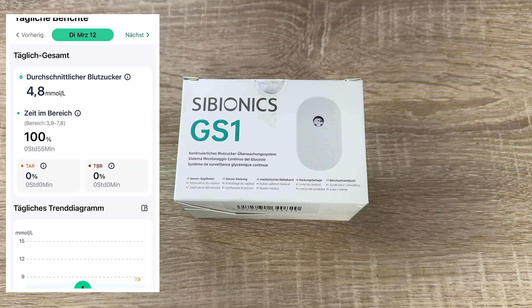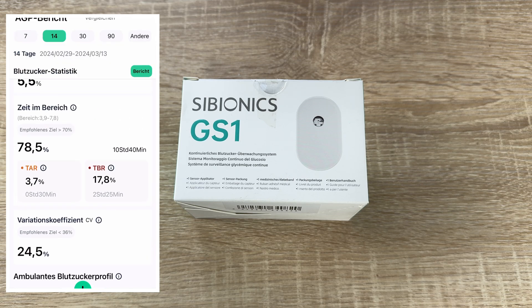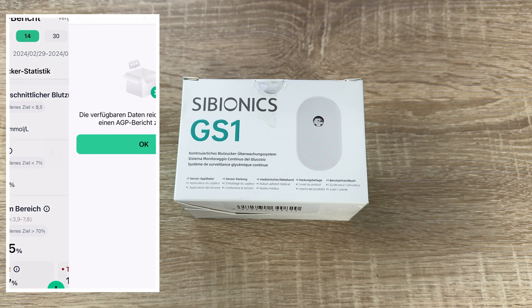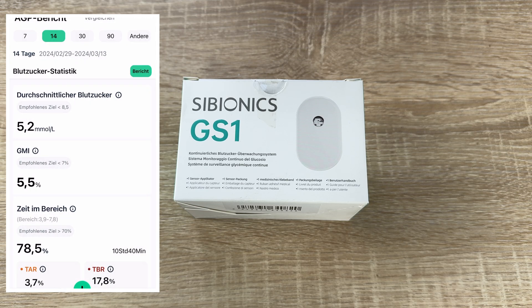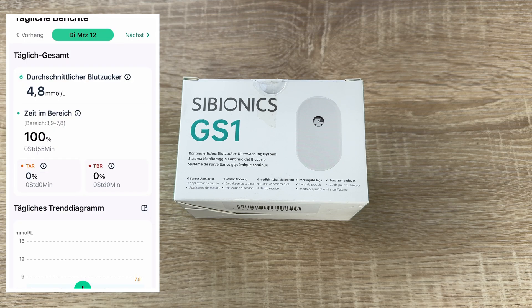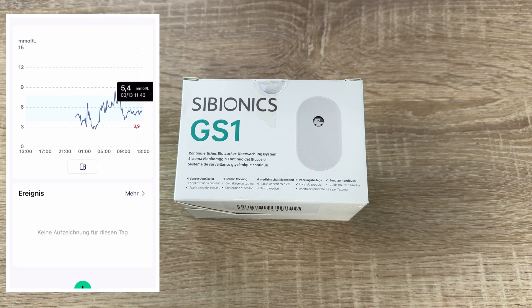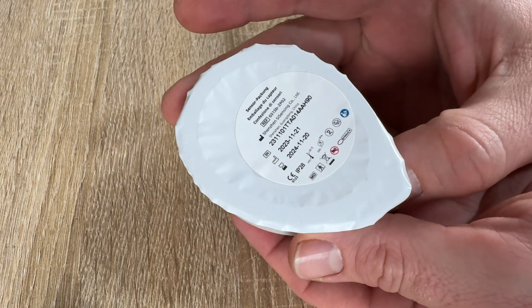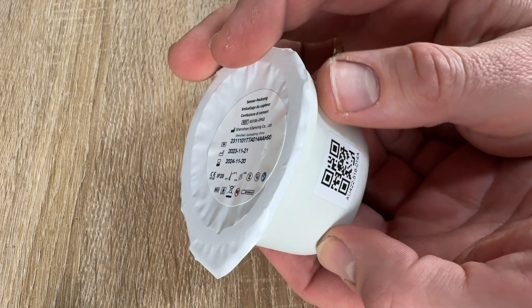CGMs are used by people who treat diabetes with insulin — for example, people with type 1 diabetes, type 2 diabetes, or other types of diabetes such as gestational diabetes. A continuous glucose monitor has three parts.